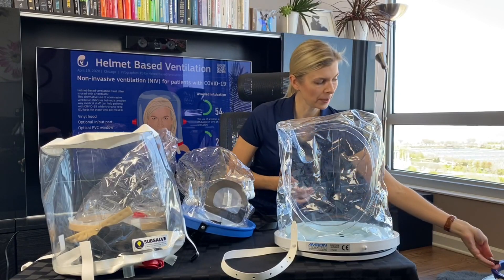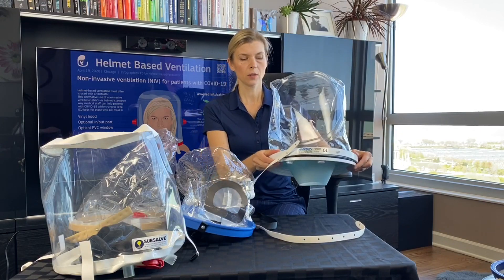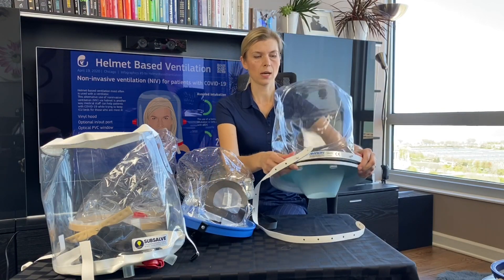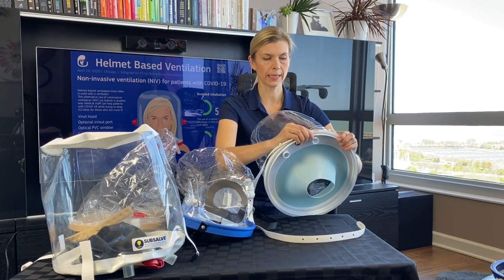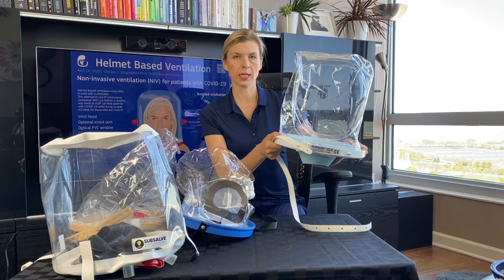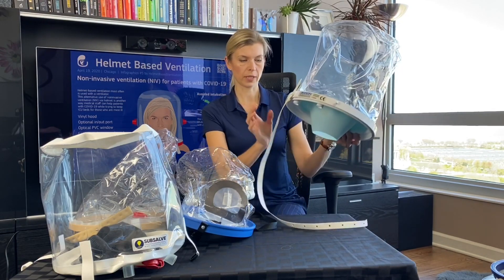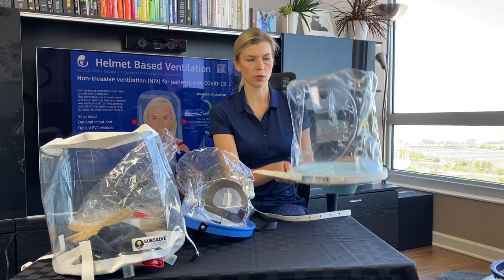Another two-piece helmet we have here is from the company Amron. It is very well made with very high quality materials. It doesn't separate under high pressure. And as I mentioned, it is already FDA approved, so it can be used on a patient.